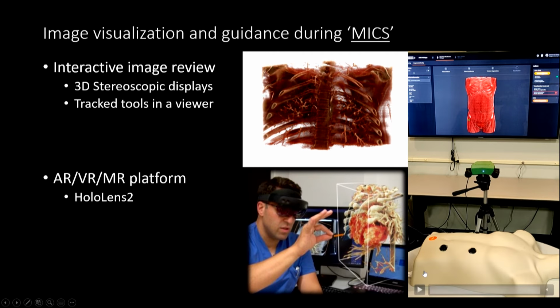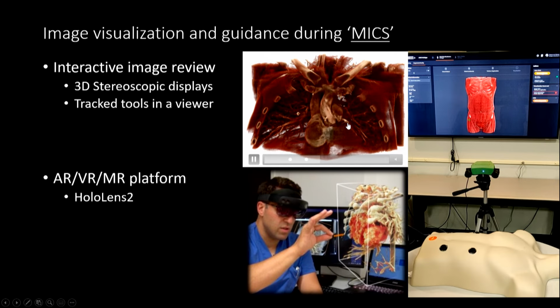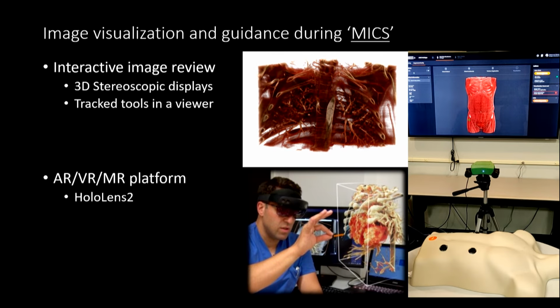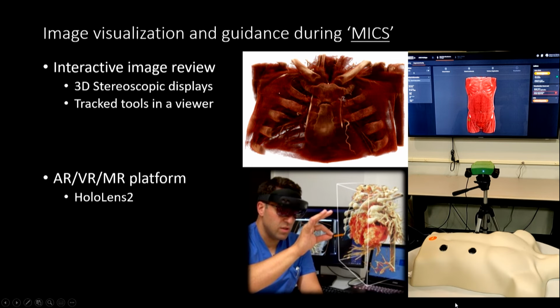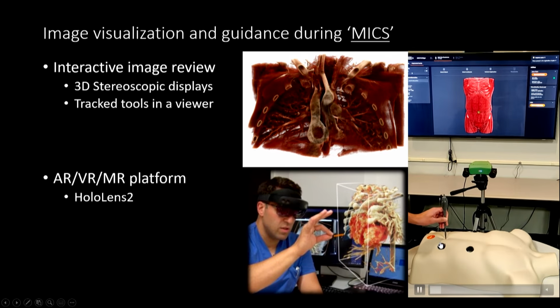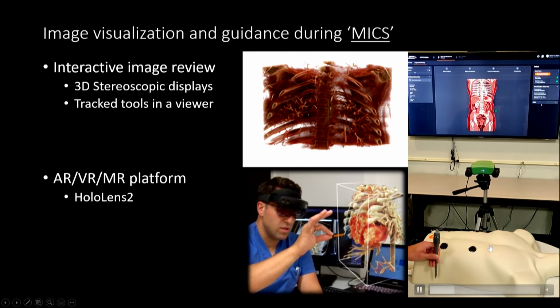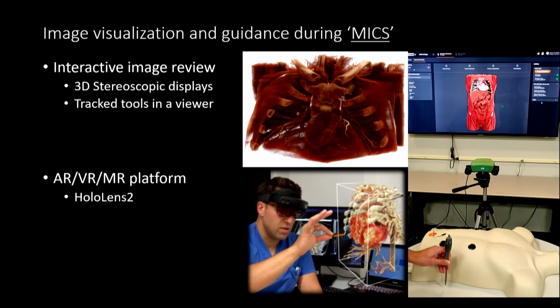But how is it done? Talk us through what we're looking at up here. So there are 2 ways. You can take a regular scalpel or any tool, and put an electromagnetic sensor or a gyroscope, just like what we have in all our cell phones, and use that to register this patient, which is what we are showing here. There are certain bony points or landmarks, so for example, left nipple, this is xiphoid. How many points do you need?